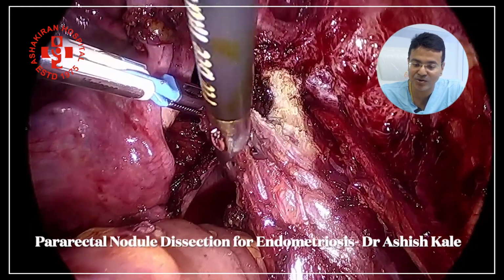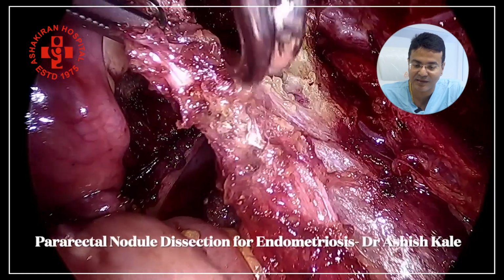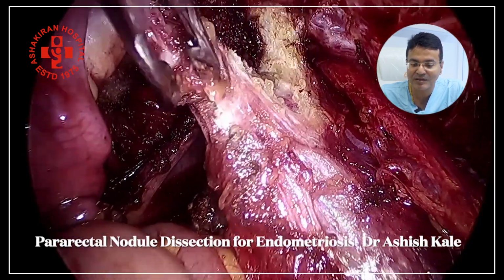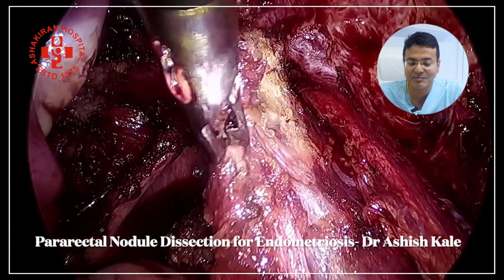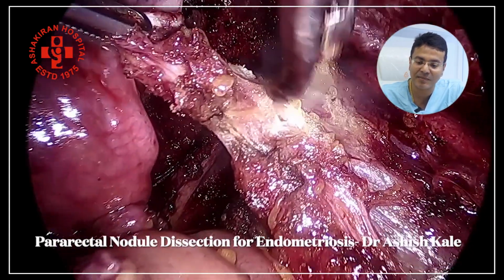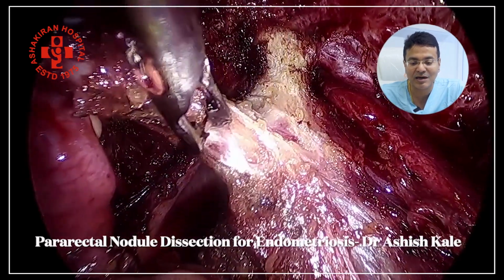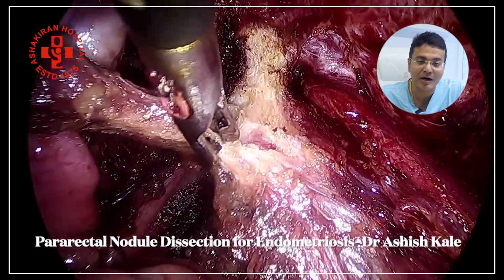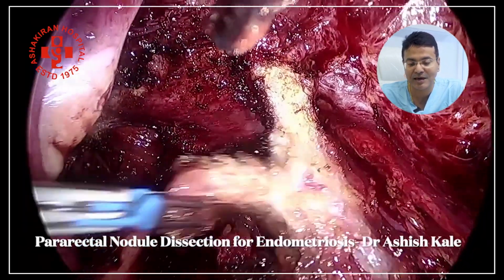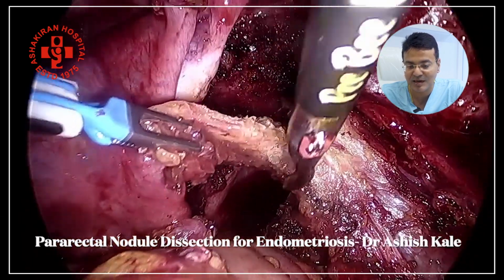You can see the uterosacral which is thicker and affected by the endometriotic lesions, and when I am cutting it down, there is a brownish material which is coming out, and this is because of the endometriosis. This particular uterosacral ligament is going to get dissected. We are just below the uterosacral ligament, so we are taking utmost precautions that it is not going to affect our nerves which are lying below or medial to the uterosacral ligament.